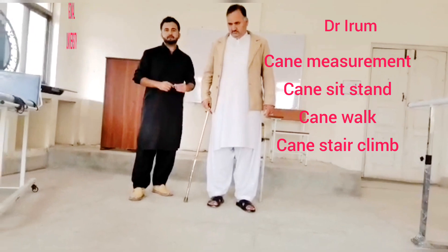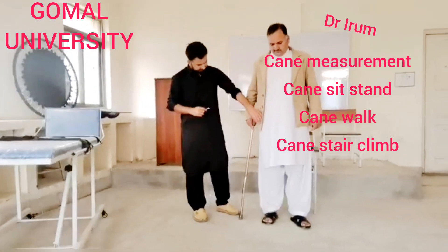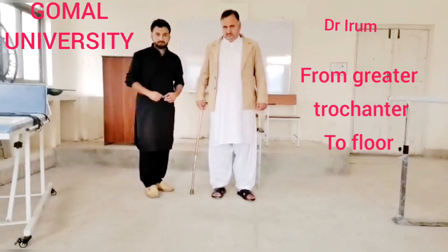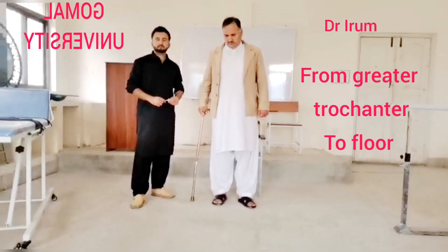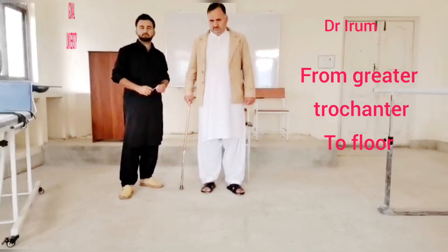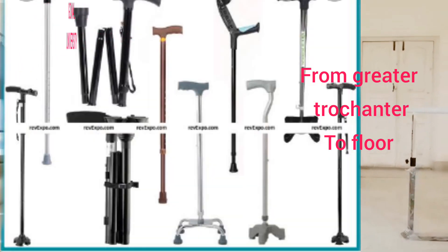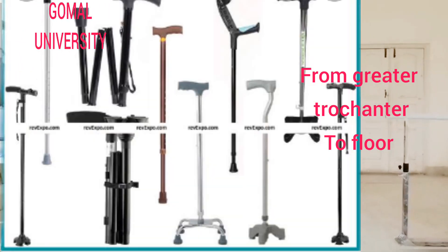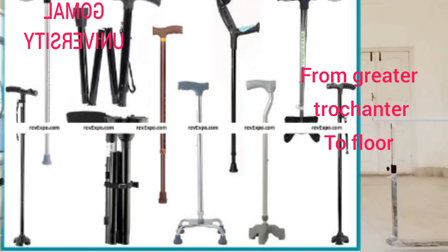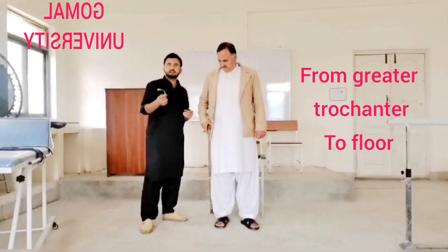This is Dr. Abin from the Faculty of Allied Health Sciences, DPT Department. We are very thankful to him for joining our video. There are many types of canes — folding canes, tripod canes, and tetrapod canes. These are used according to the patient's strength. If the patient has good strength, then we give a simple cane. We also check the ferrule — as you can see, at the end of each cane there is a rubber ferrule.